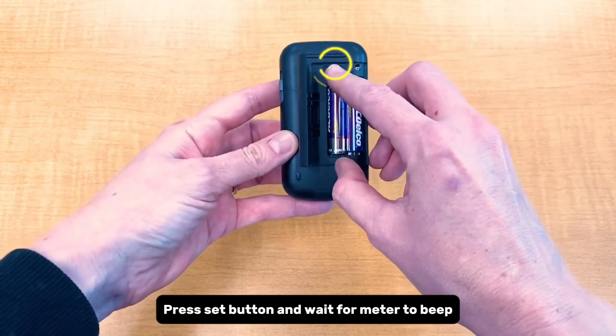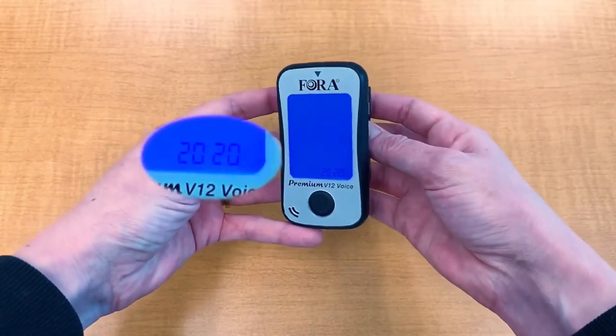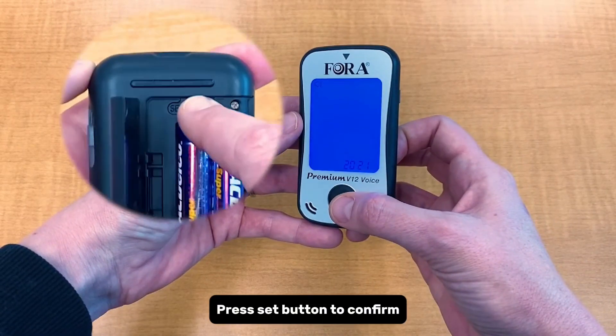Press the set button and wait for the meter to be ready. To set the year, press the main button to change the value, then press the set button to confirm.